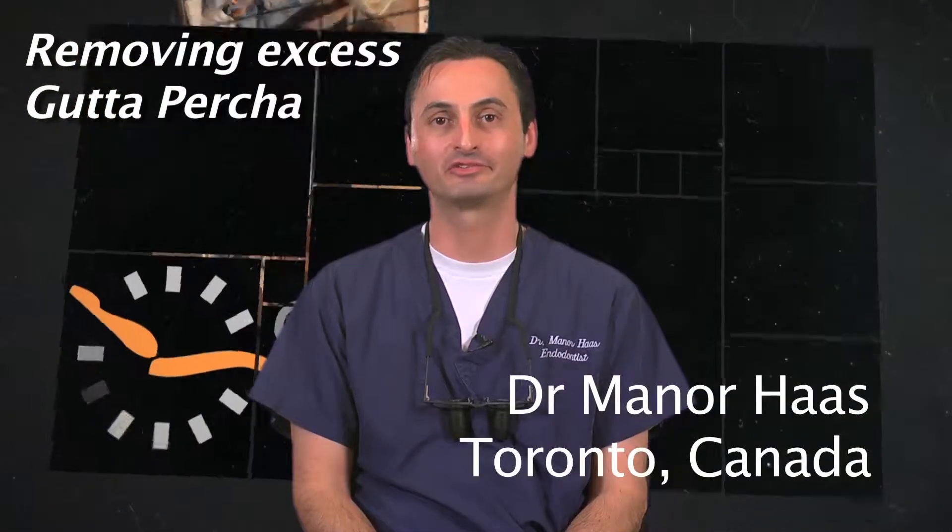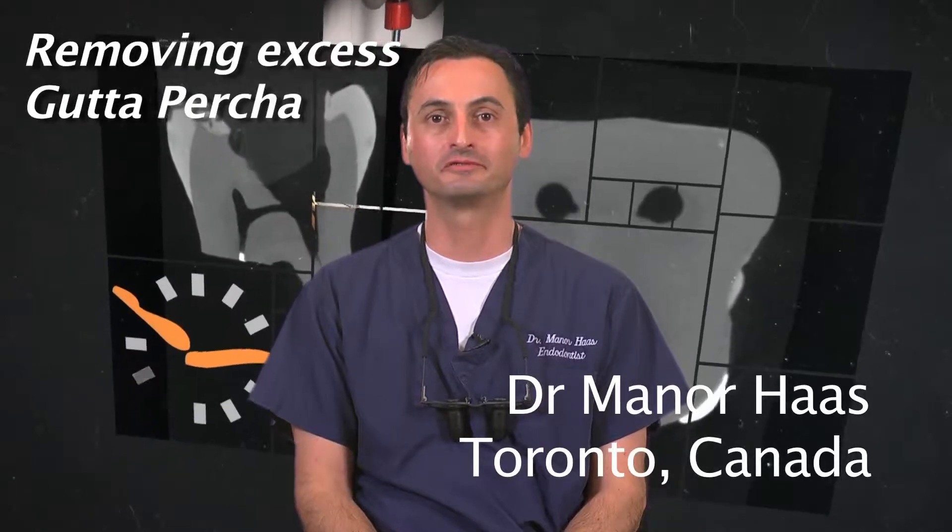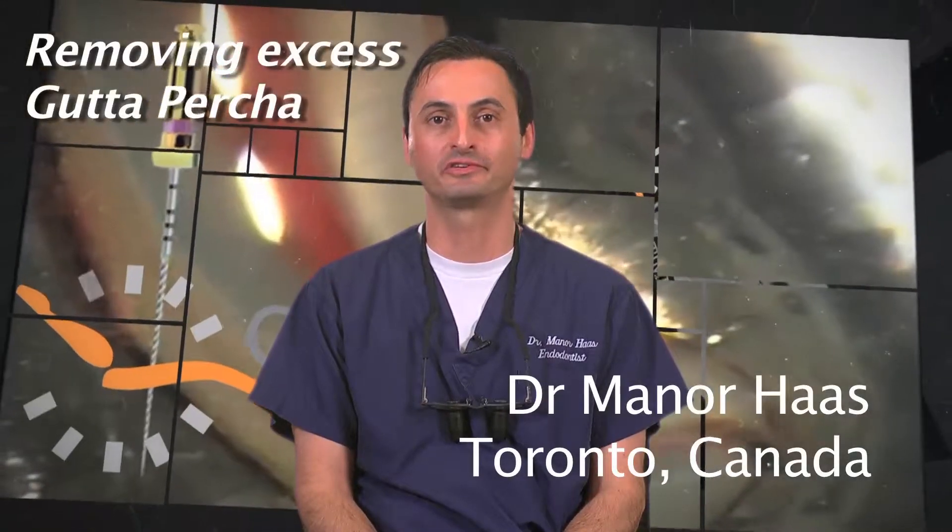Hello, I'm Dr. Menor Haas. I'm a certified endodontist from Toronto, Canada. In this segment I would like to review the removal of excess gutta core material in the pulp chamber.